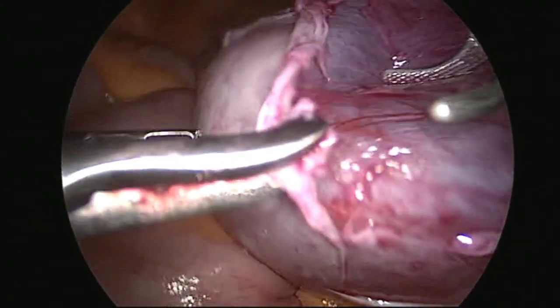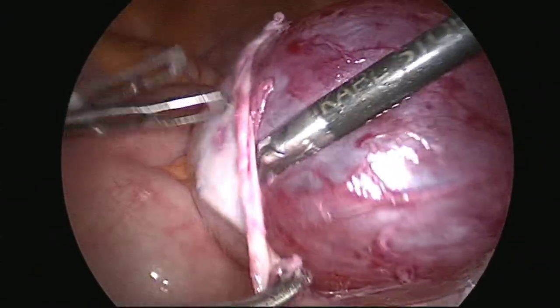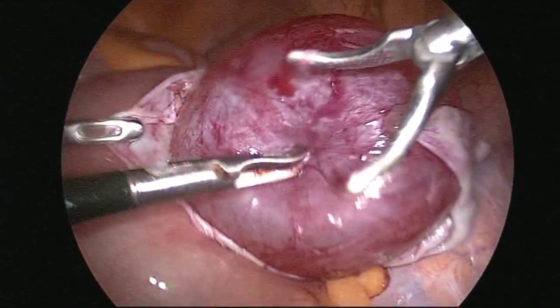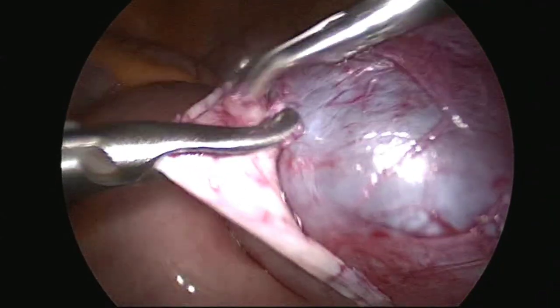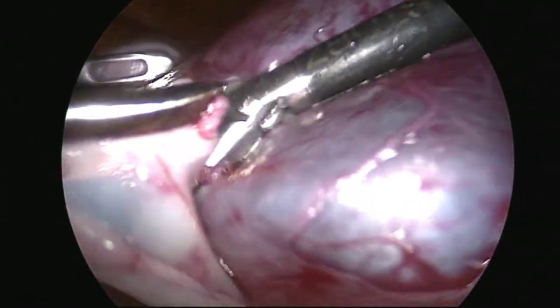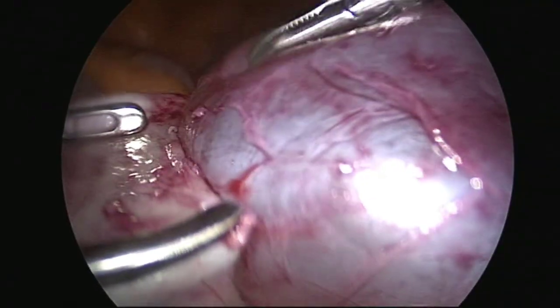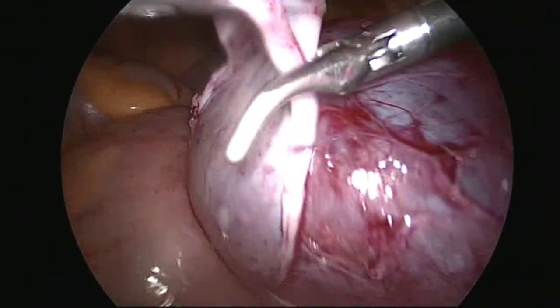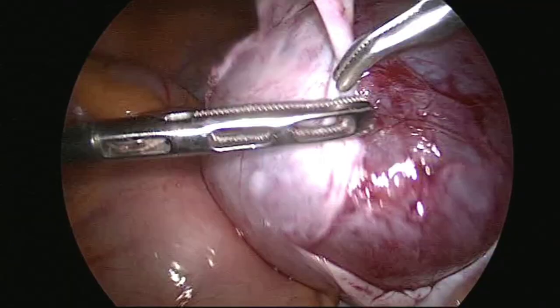Almost it gets separated. I think 10 to 20% is remaining, that I have to separate slowly. Now I don't want it to rupture. You can see the cyst is coming out like a cricket ball. You can see now we are near to separating fully, and the time taken is just 12 minutes.